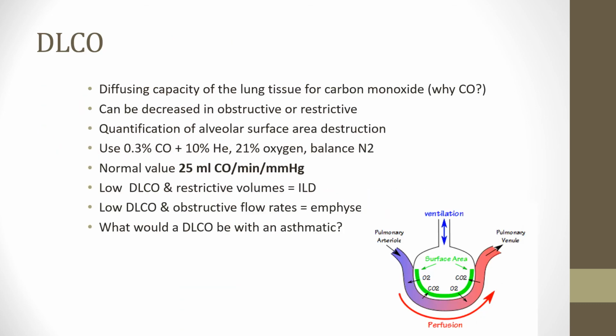All right, the DLCO, we talked about this one in pulmonary. This one's great for looking at how easy it is for gas to cross over the alveolar-capillary membrane. Very important for conditions like emphysema, interstitial lung disease, titrating chemotherapy. These are very, very important tests. And when we're looking at it, we're using carbon monoxide. Why carbon monoxide? Remember, 200 to 250 times the affinity for the hemoglobin molecule compared to oxygen. That's crazy. So it really loves to be diffused into the bloodstream because it is in love with that hemoglobin molecule.